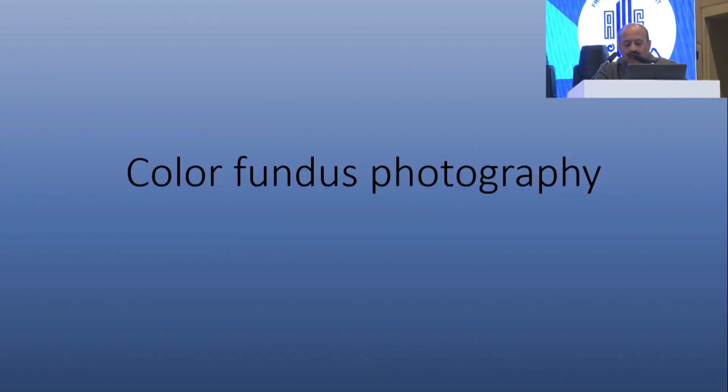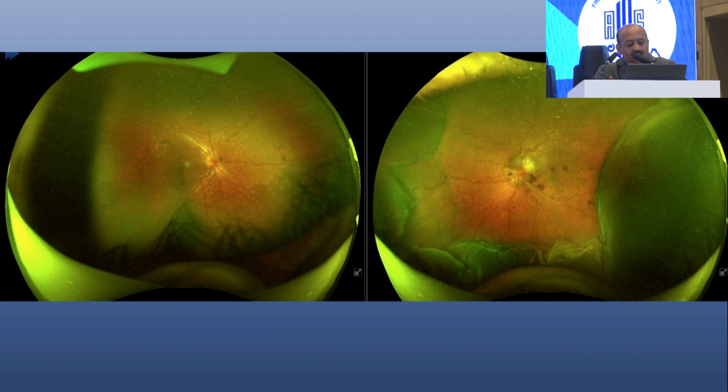So I'll be talking about a comparison of retinal imaging with Heidelberg and Optos, and what the advantages and disadvantages are. First of the multimodal imaging is color fundus photography. Now, you have seen these beautiful images of the Optos. There is no comparison between Optos technology and Heidelberg as far as color imaging is concerned.